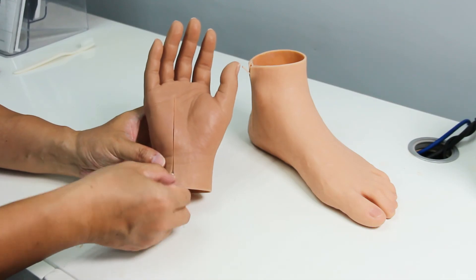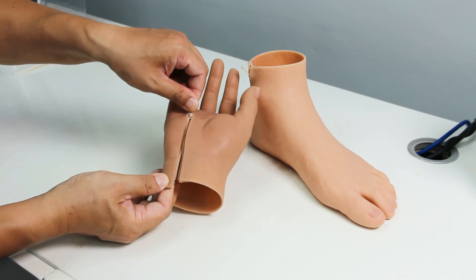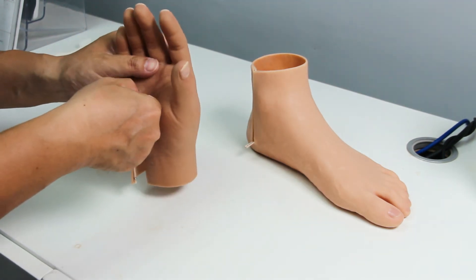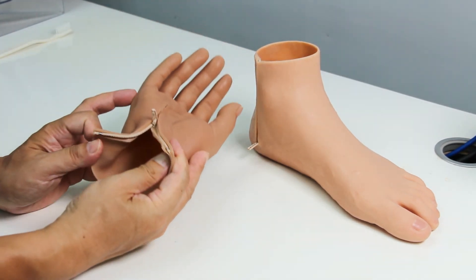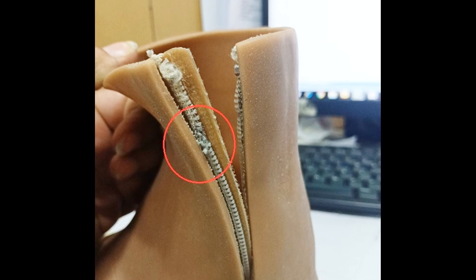The correct way of donning and doffing the glove or foot cover is to unzip all the way to the end of the zipper. If the patient moves the zip only halfway and then wears the glove, the stretch will put pressure on the zip teeth, which will damage the teeth. Once the zip teeth are damaged and cannot be repaired, the glove or foot cover will have to be refabricated.